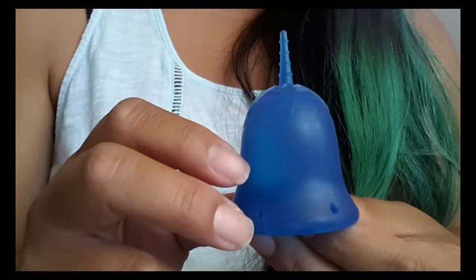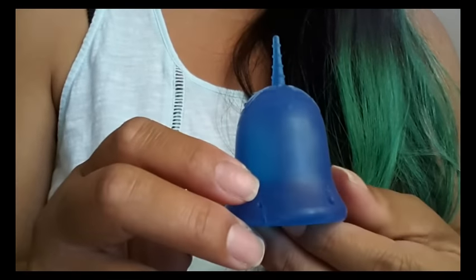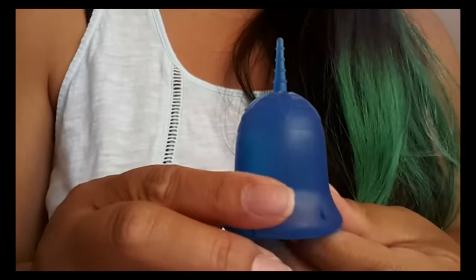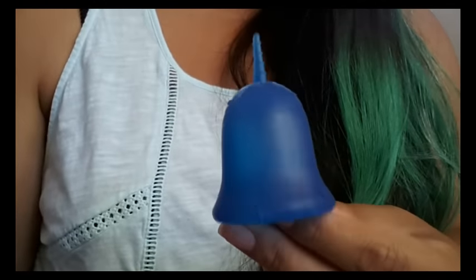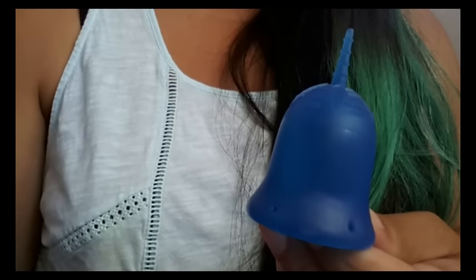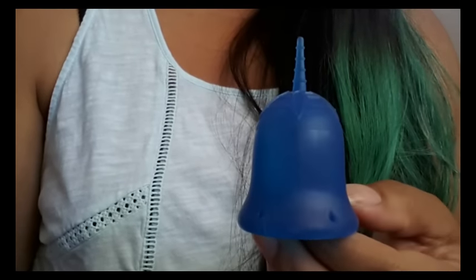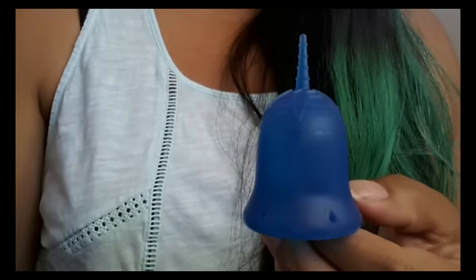Originally the Scoon Cup is $39.99 but they are having a sale — I don't know how long that sale runs — but the sale price is $36.99. So pick that up as soon as you can if you want to try out this cup. They offer the cup in two different sizes: size 1 and size 2, with size 2 being the larger of the two.